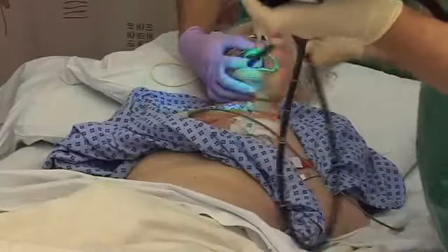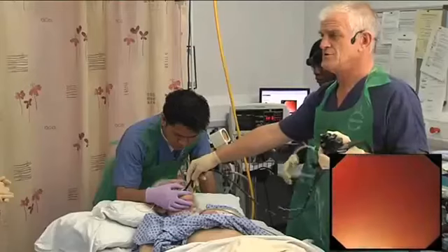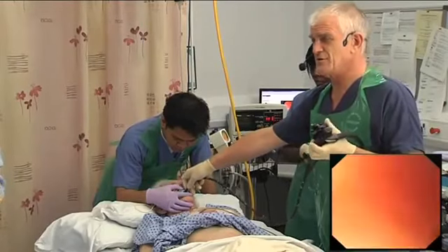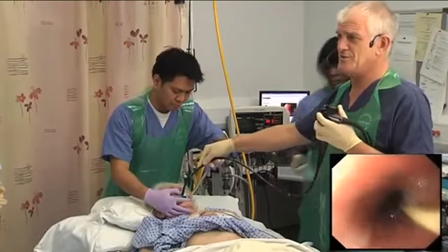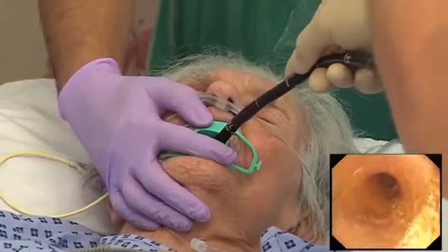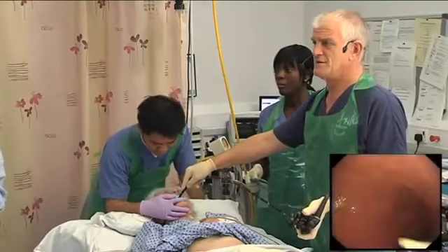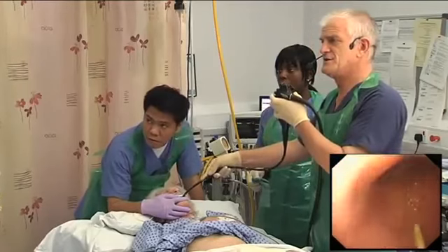Okay, we're just going to pop the instrument in, following the feeding tube down. It's often quite difficult to intubate with the patient on their back, and so I tend to leave the feeding tube in and follow that down. We'll take it out when we put the PEG tube in. Okay, we're down into the stomach. Got quite a big hiatus hernia, actually.